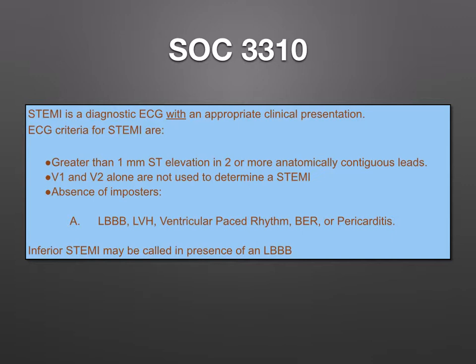Let's first review the ECG criteria since I feel comfortable most everyone knows these pretty well, and then we can discuss the more troublesome question of what is an appropriate clinical presentation. Almost everybody universally will agree that these criteria for an ECG are truly the criteria for a STEMI. The appropriate clinical presentation is a lot more confusing and different people will vary on different things. The concept that we're going to talk about though is very well accepted. It's not just the EKG, it's not just the story, it's the combination.